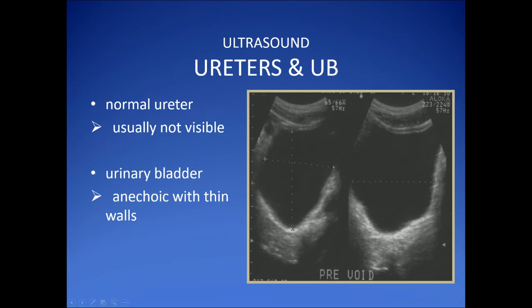So by sonogram, we can actually compute for the pre-void volume of the urinary bladder as well as the post-void volume. So we can say whether there is a significant urinary retention or none.